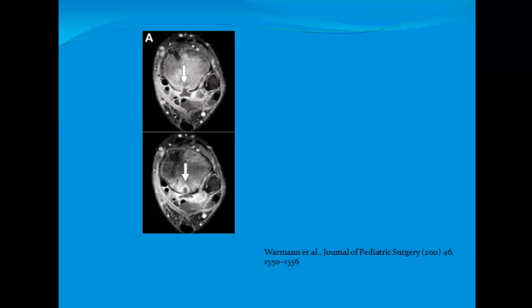So here's an application that was discussed in the literature. I don't know how realistically applicable it really is, but there are patients who have osteomyelitis, for example. We could consider doing PET-CT. We wouldn't want to do them in all patients presenting with osteomyelitis because of the radiation burden. But what they saw in this particular group was that patients with recurrent osteomyelitis that was not well characterized on MR for being positive or negative might benefit from having a PET scan done.